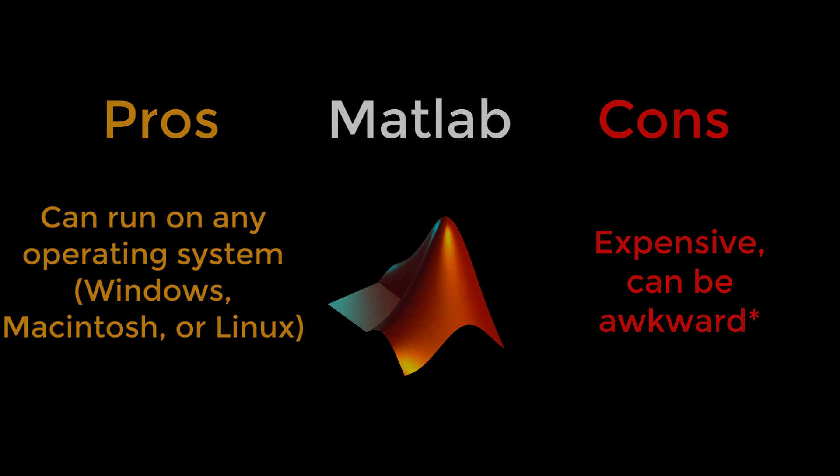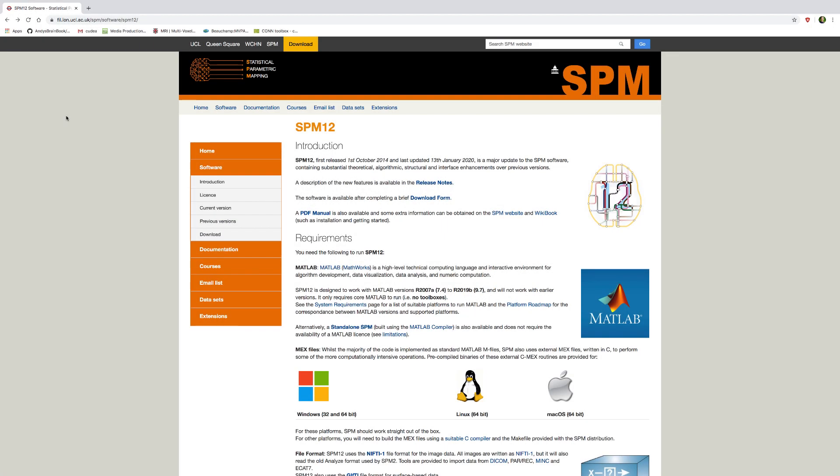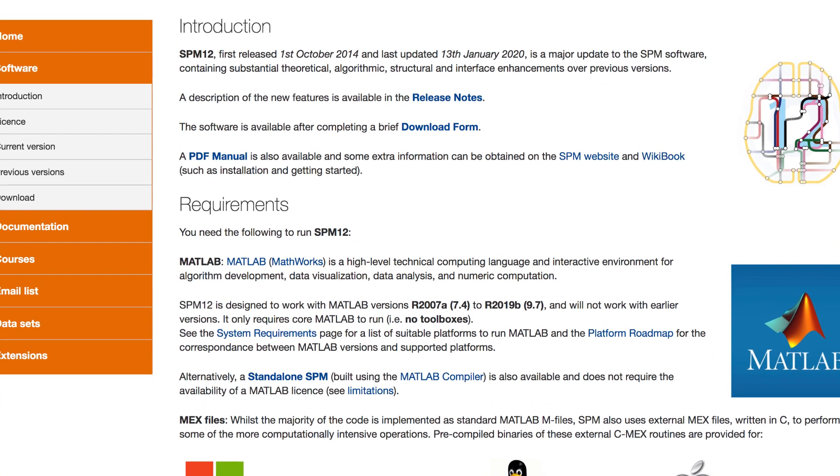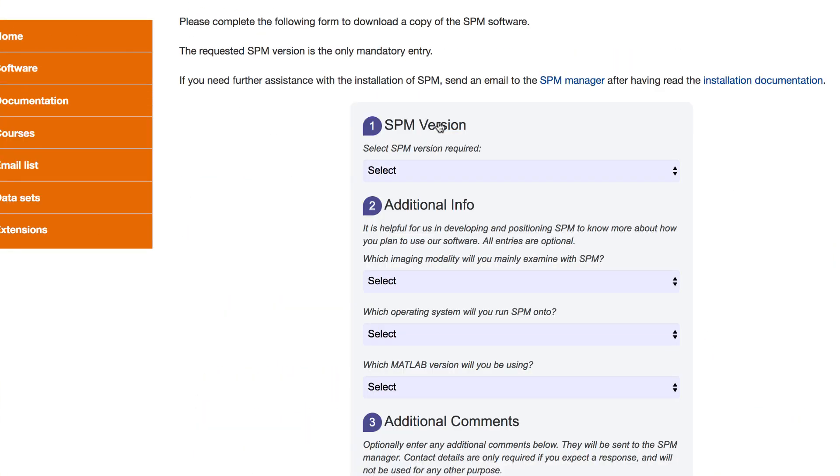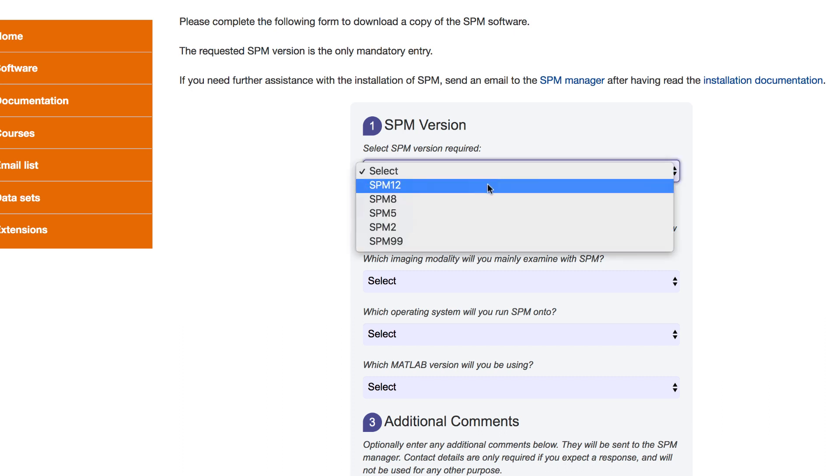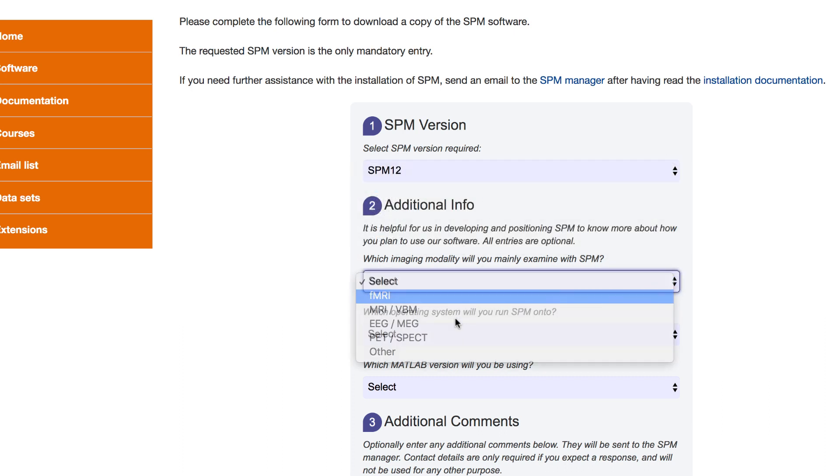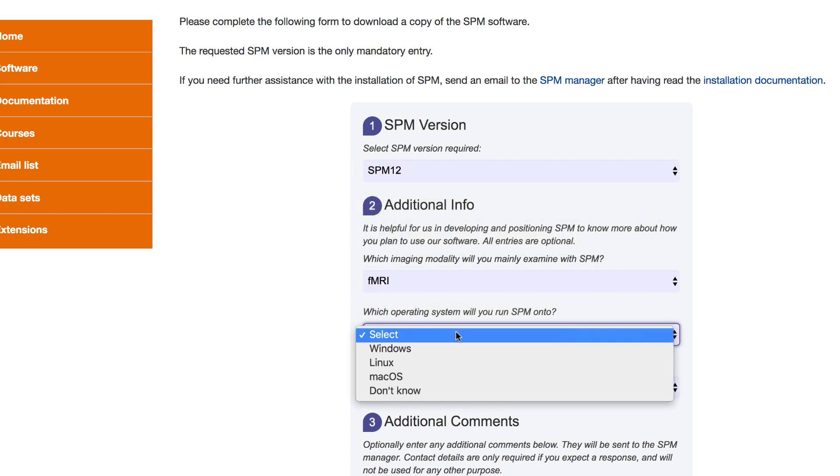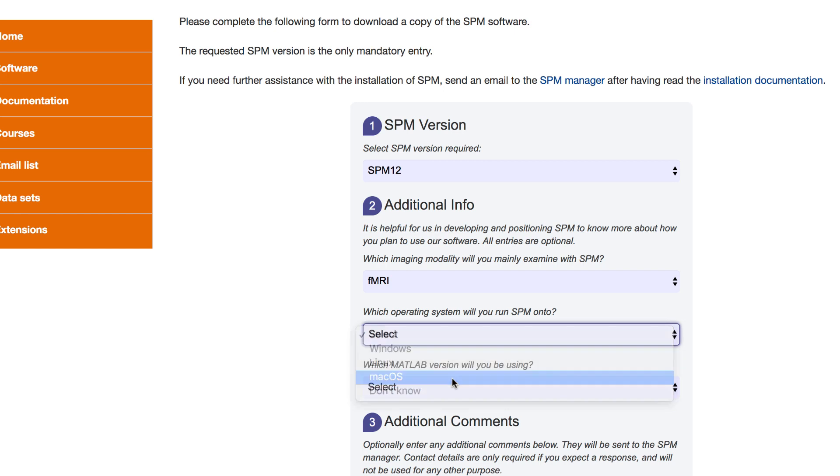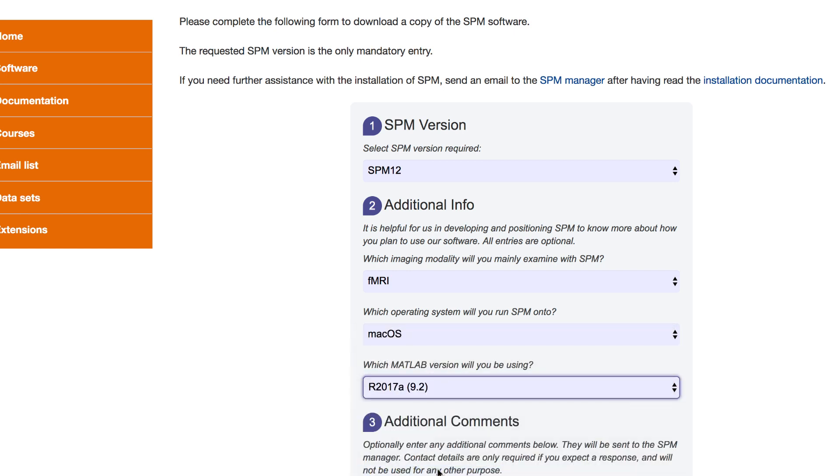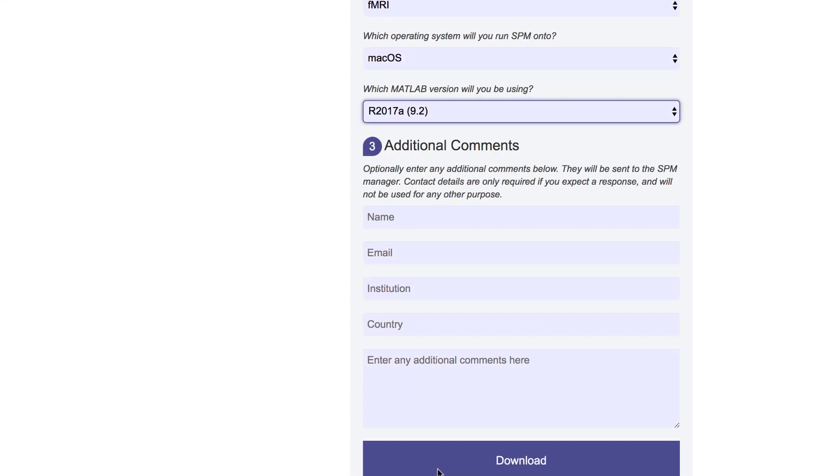So how do you get SPM? Assuming that you have already downloaded and installed MATLAB, you should first go to the SPM 12 website and click on the download form button. Select SPM 12 as the version that you want and fill out the rest of the details.